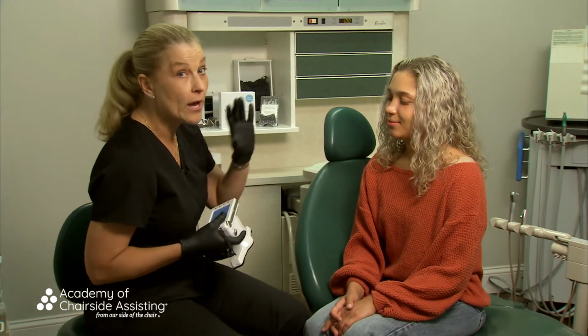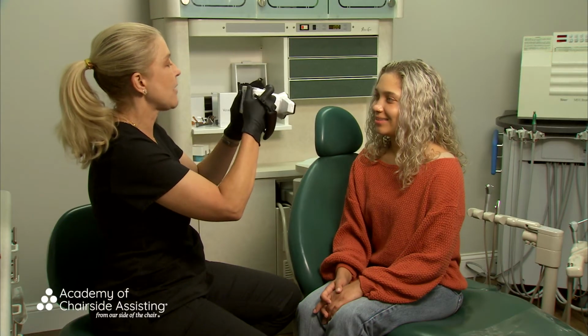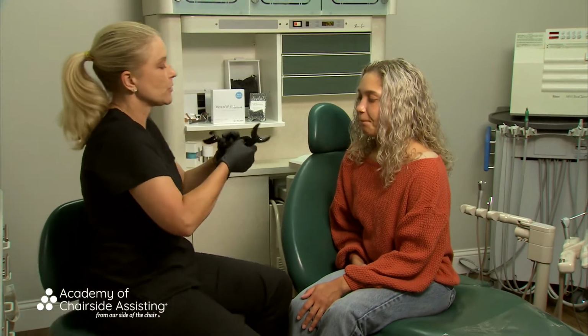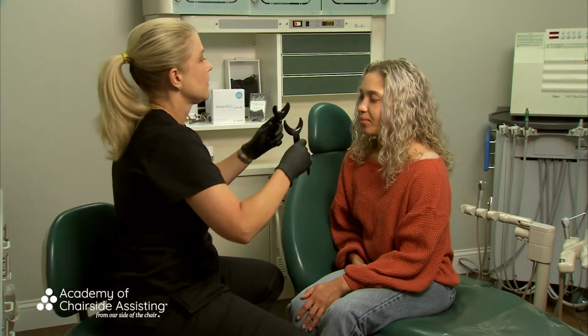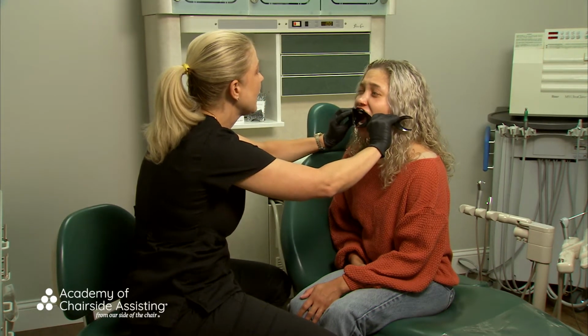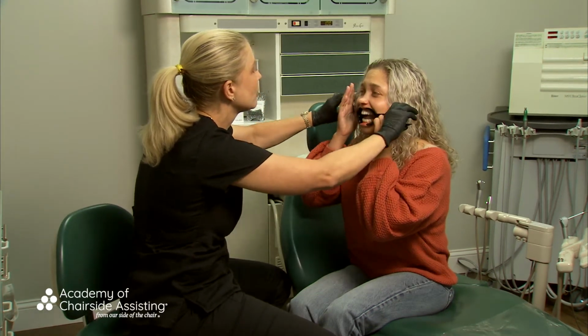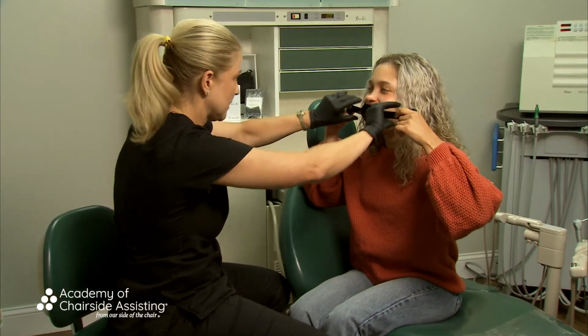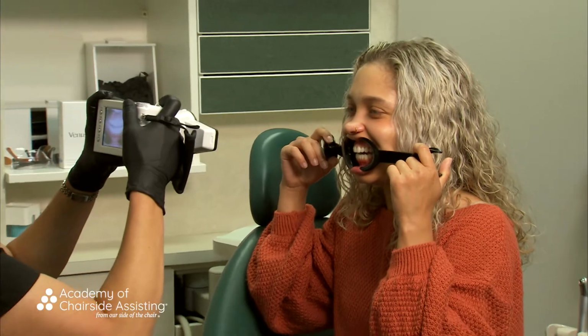So I'm going to go ahead and take my full face photo, and then I'm going to jump right to my smile shots. So Haley, what I'm going to do is I'm just going to have you smile really big for me. Beautiful. And then I'm going to just have you lick your lips for me really good. And I'm just going to slip these in. Okay. And I'm just going to slide these in. And I'm going to have you do me a favor, Haley, and hold those. And hold them way out here to the end. Okay. Perfect. I'm just going to take a quick photo of you.